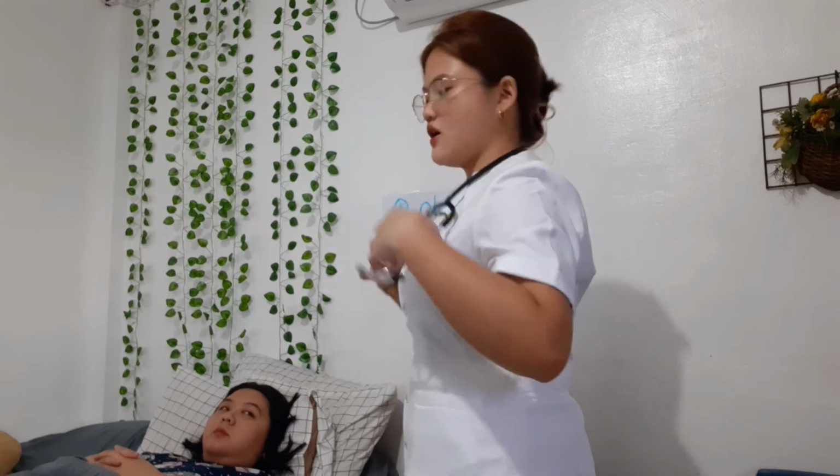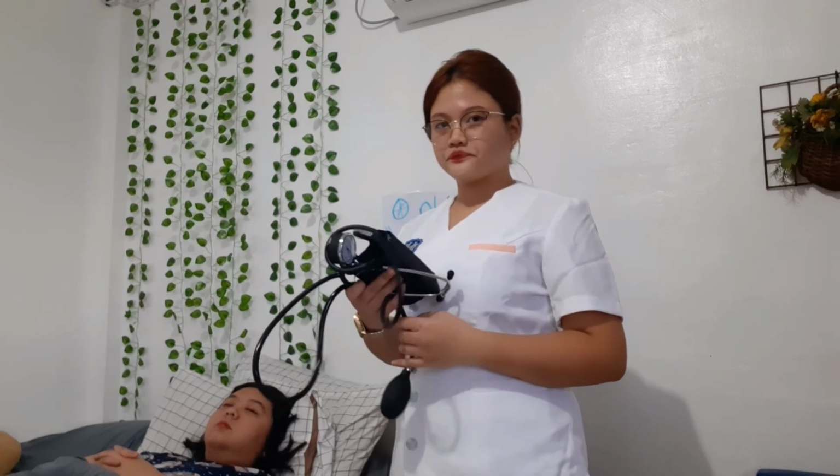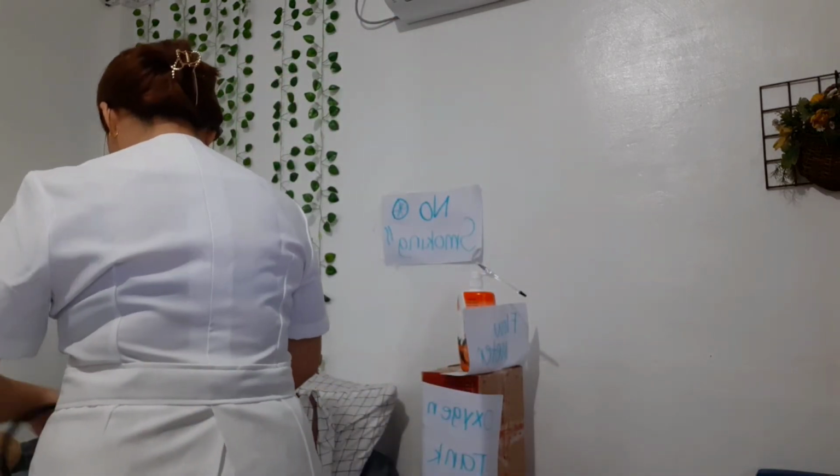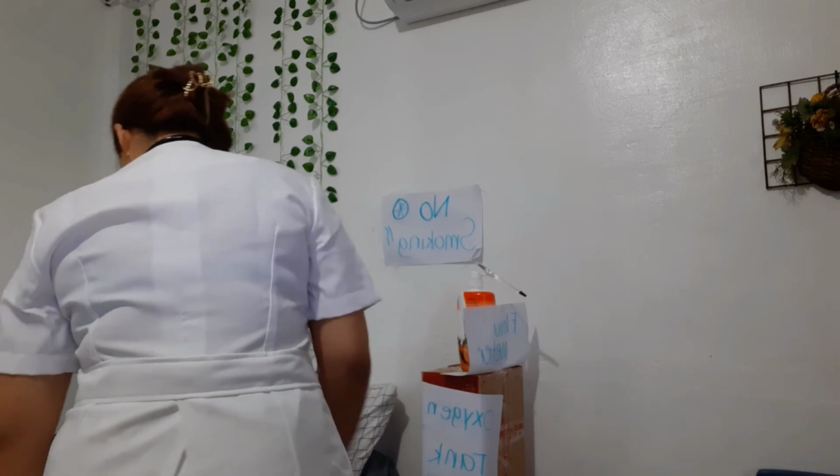The rationale for that, it is in order to detect and address any untoward response from the therapy. So, of course, the next one is you need to assess the patient regularly for clinical signs of hypoxia, tachycardia, confusion, dyspnea, restlessness, and also cyanosis. So, I will do first the patient vital signs.